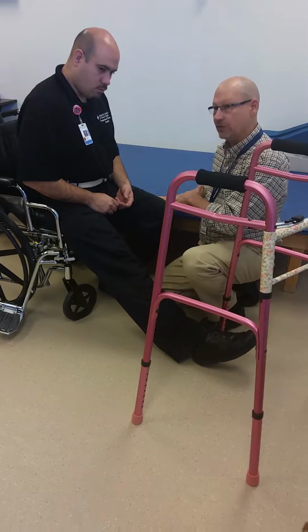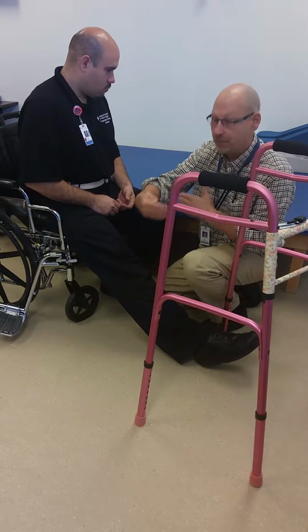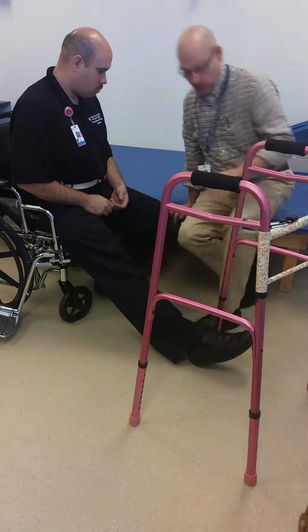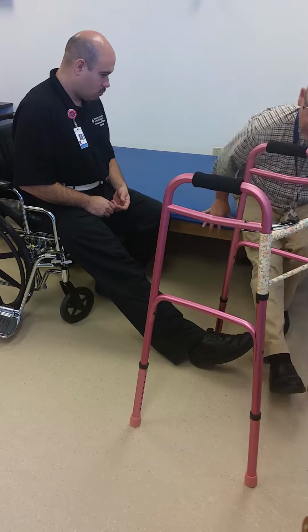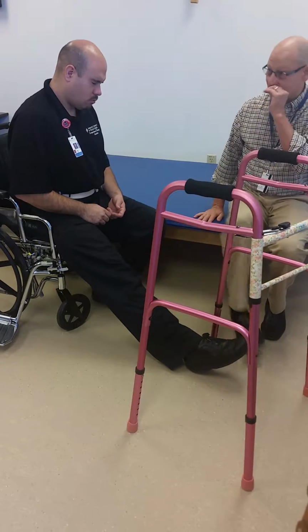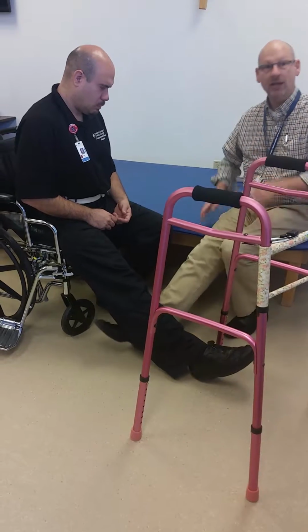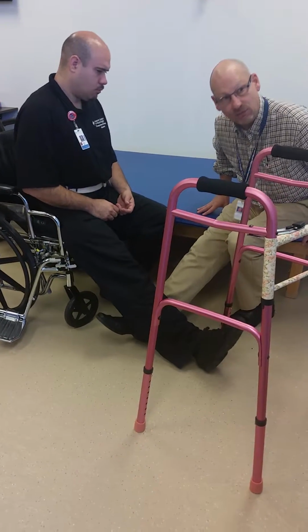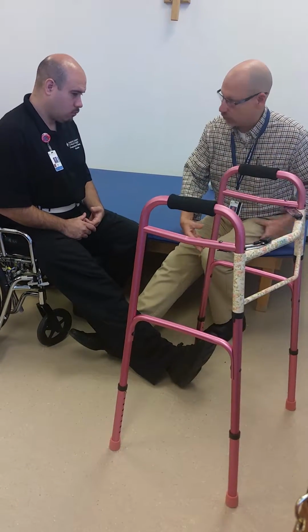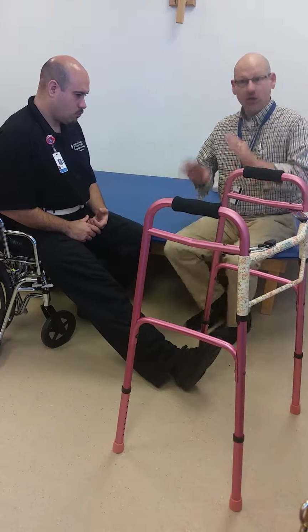The lower the surface it is, the more the patient needs to lean forward. So if Randy was sitting over here, he would have to go out even further so he could lean even more. Does that make sense? It's a big, big thing to understand why the person extends their leg, simply so they can lean forward to get their center of gravity over the base of support. Good? All right. So now we've got him.